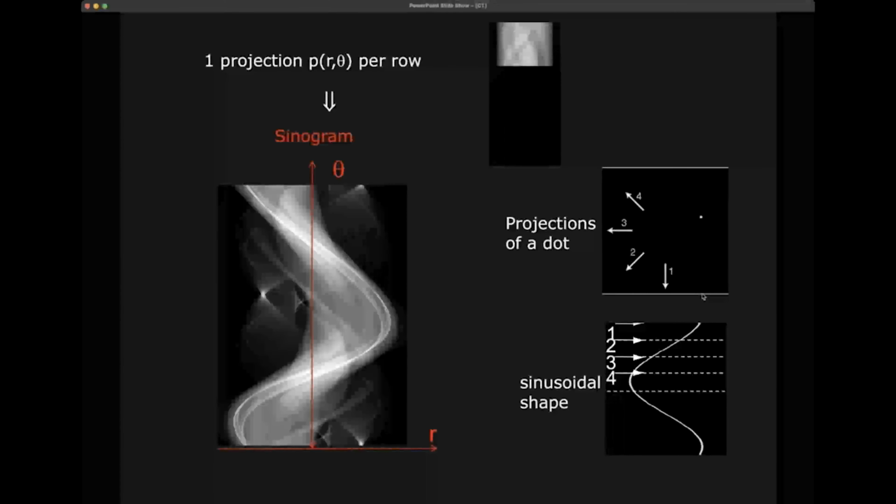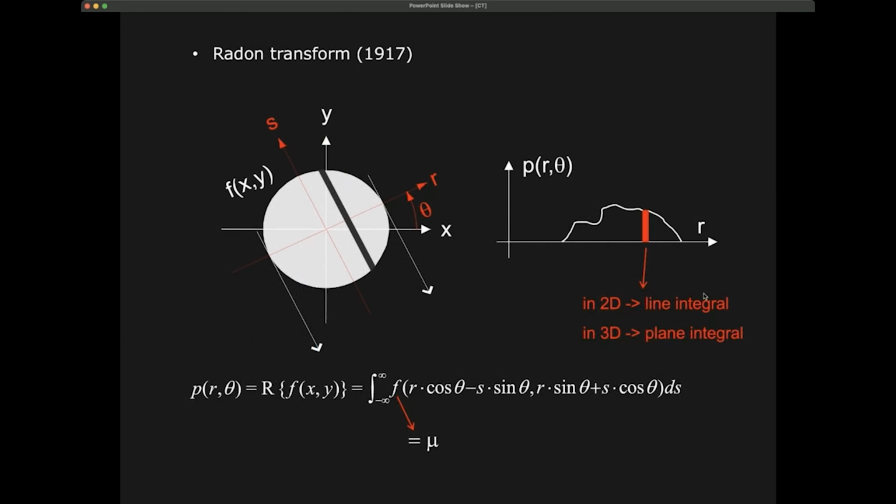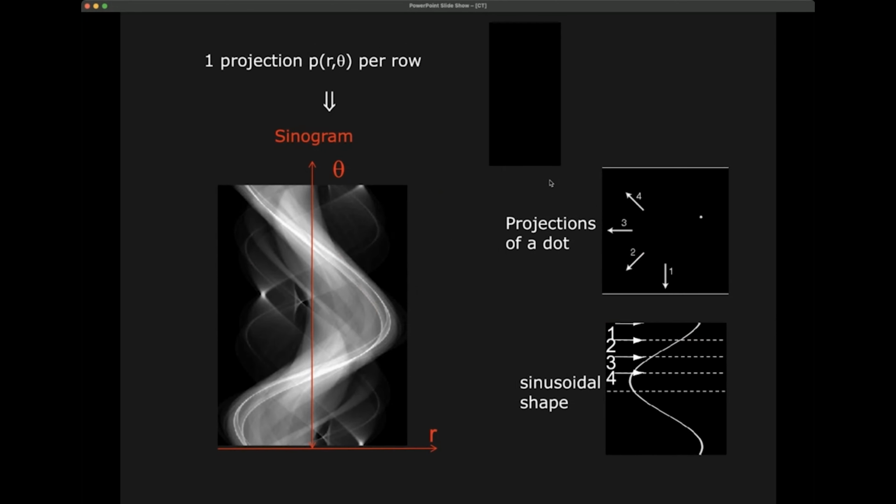We will have a big white dot. That's this white dot, because here absorption will be very high, which means that the intensity will be very low, which means that then this transformed one will be bright. Then we're going to start rotating our source.